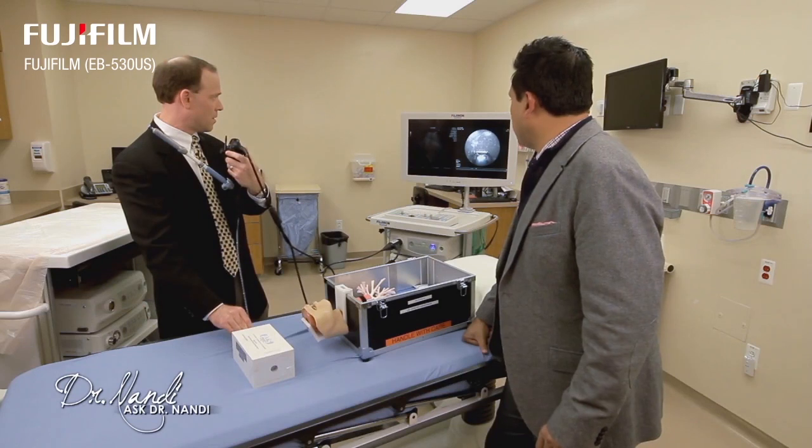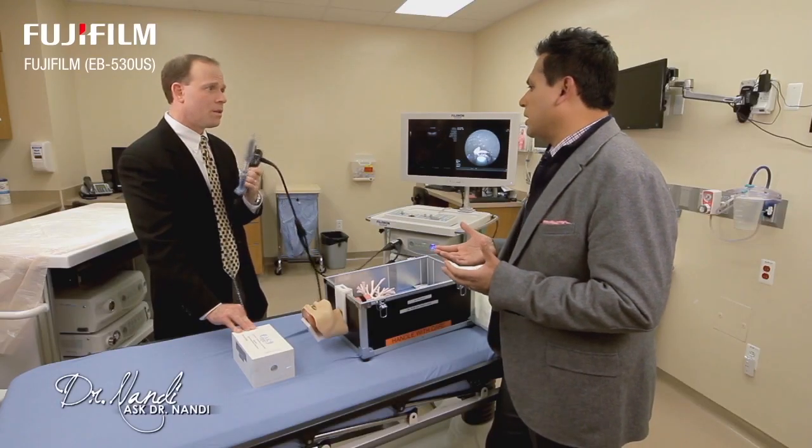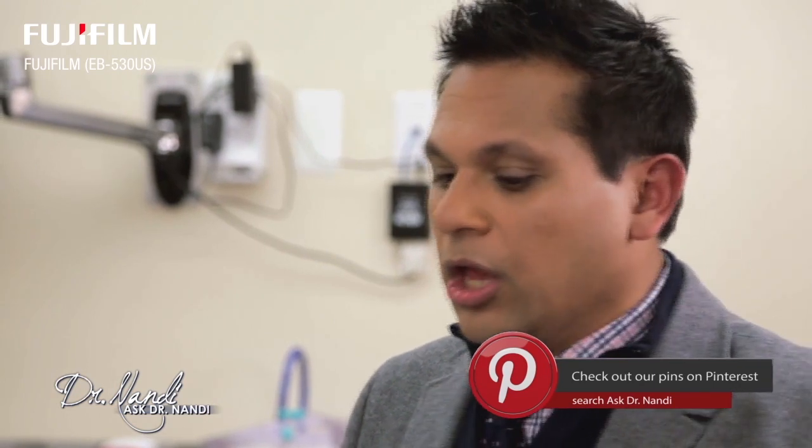And the idea is that before we had this technique, it would be very difficult to do these biopsies. It would be very invasive. And so now, this makes it so much easier. The old-fashioned way would have been to make an incision just above the sternal notch and have a surgeon put a scope down. How far we've come, huh? Yeah. It's so invasive. Think about having somebody cut on you. Instead, that's right, you go through the same opening that exists and do these biopsies.